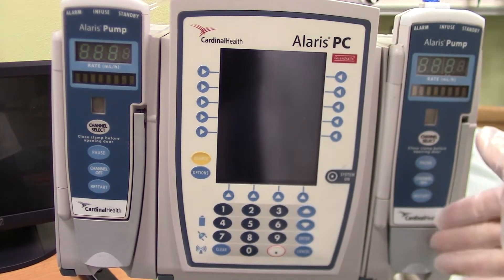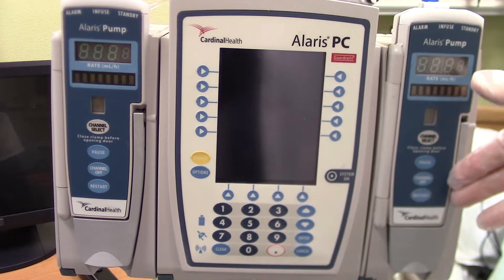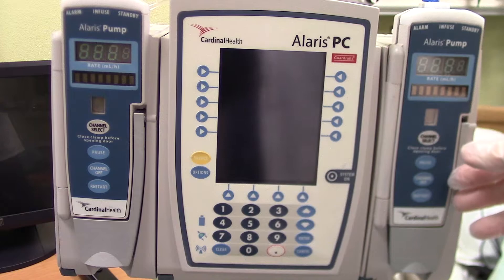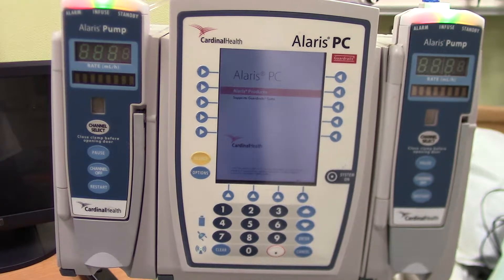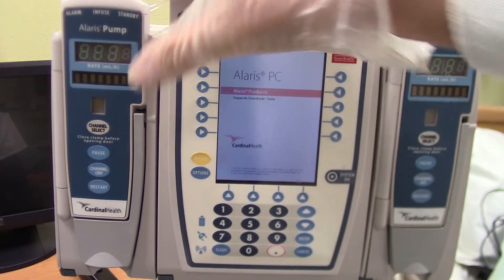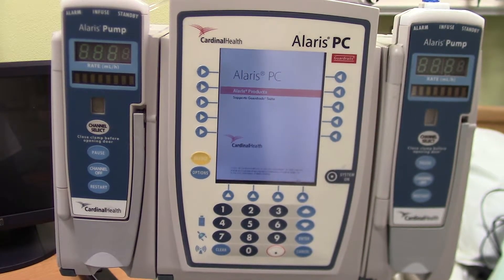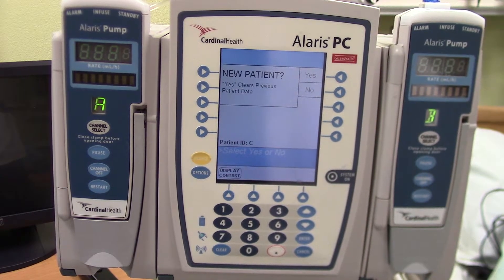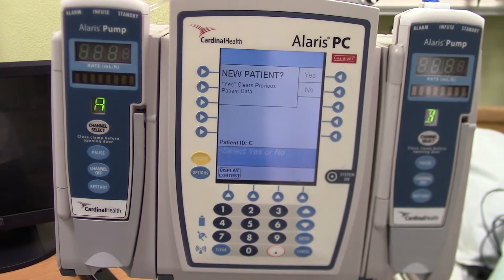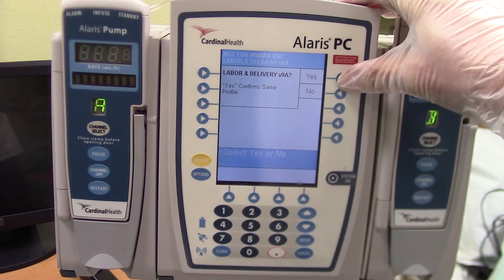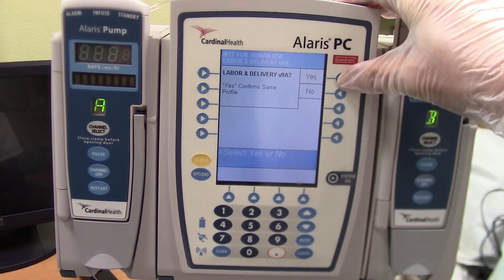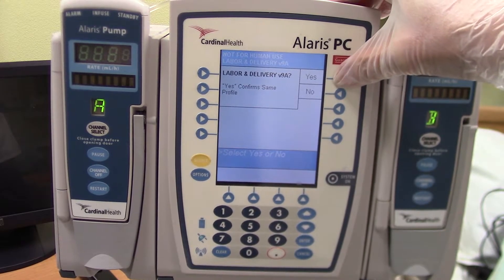The pump has already had the tubing placed inside one of the channels so that we can focus on the programming. I'm going to start by initiating the systems-on button. You will see that both of these modules or channels begin to light up as the machine boots up. The center is asking whether this is a new patient or not. I'm going to select that it is a new patient. We've last used labor and delivery as the patient environment, and we will continue to use that for this Pitocin.